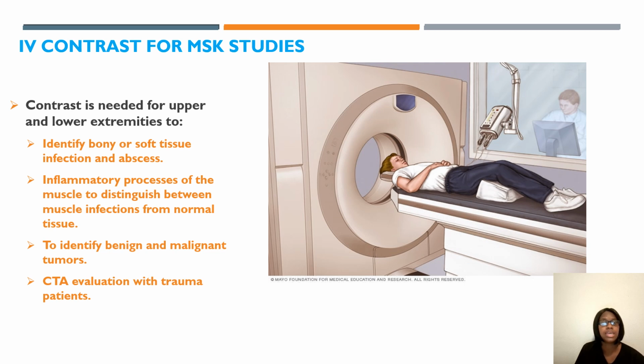So just make sure that you are aware of your pathology and why it is ordered if it's for an MSK study.